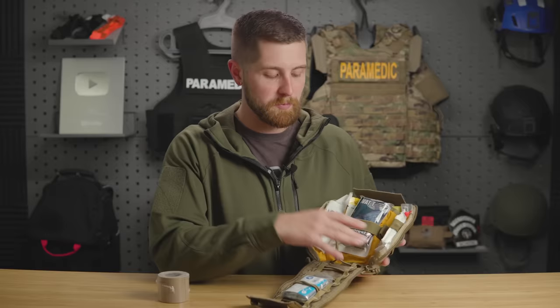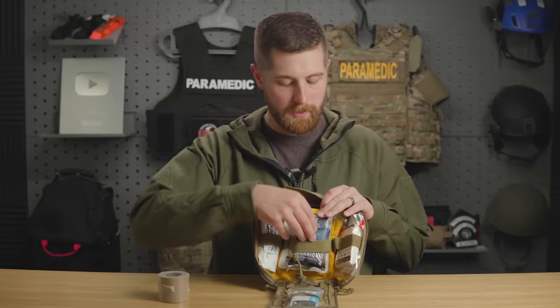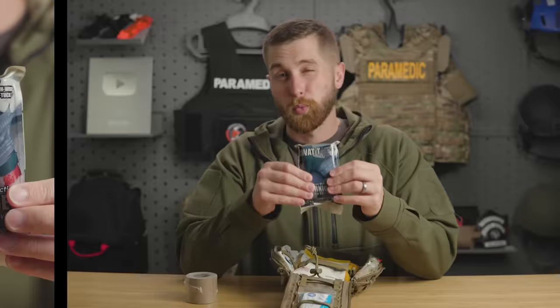So coming in here a little bit more. We already have the CAT tourniquet on the outside. That's your primary tourniquet. That's your TCCC approved tourniquet. You also have a SWAT T. Now, as far as your kind of off-label tourniquets, this is one of my favorites. It is not good for self-application. It's really hard to put on.